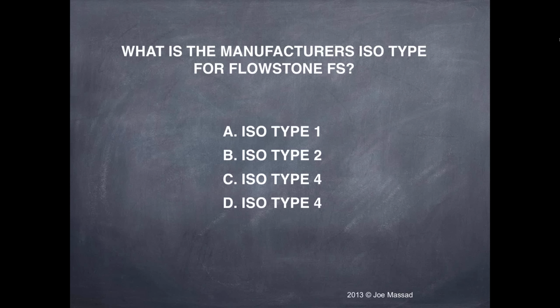Play-Doh is not quite as easy, and the other material, which I've only been using recently, works very nicely. I have to remember the name, it's called Wonderfill. It's not that inexpensive, but you can elect to reuse it as long as you make sure you disinfect the model.